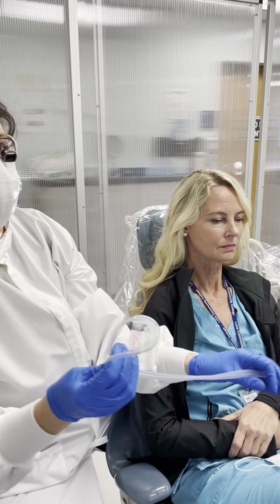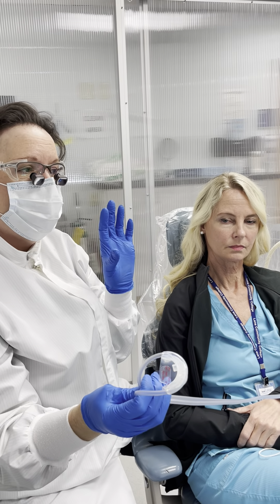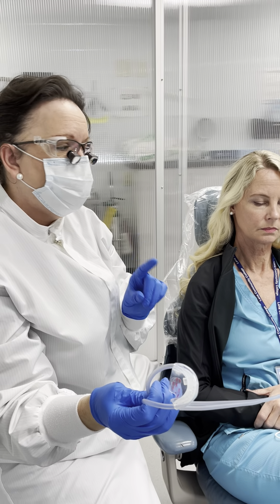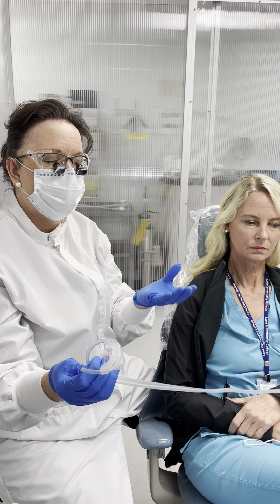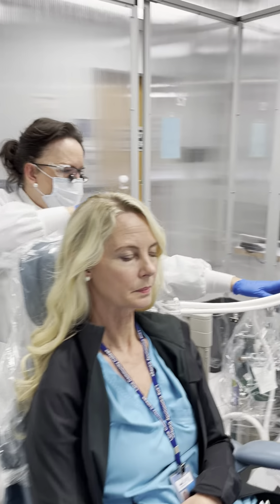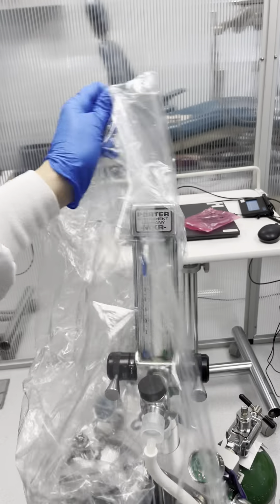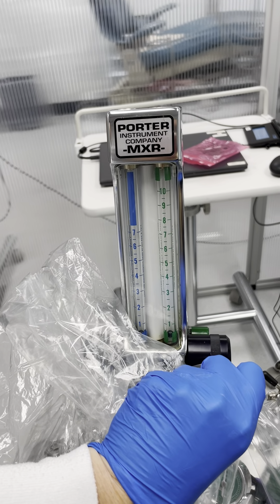Before you put the nasal mask on the patient, you want to make sure that they have gas coming through the flow meter. With a traditional type of nitrous equipment we use the 4-5-6 rule, but this particular nasal mask uses less gas than the nasal hoods used on the bag system. So we're going to start with 3 liters of oxygen.